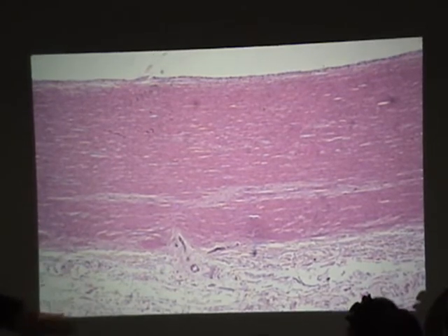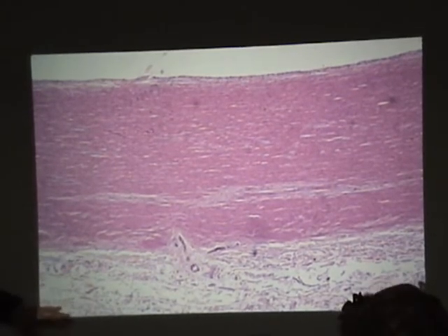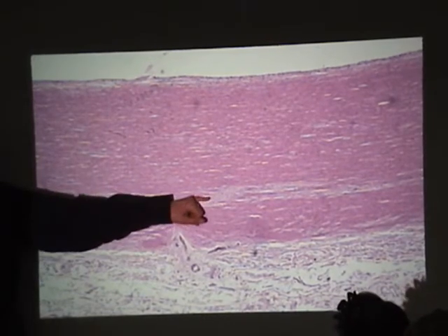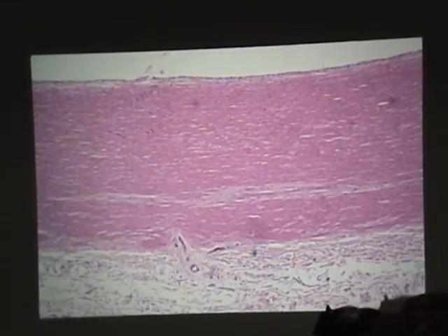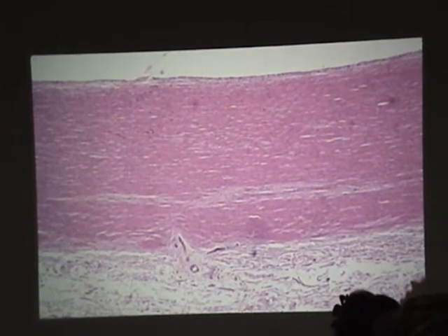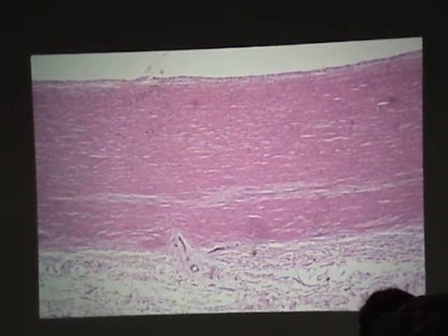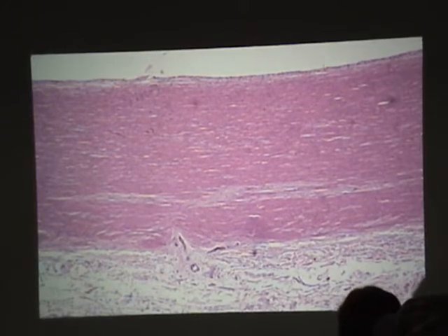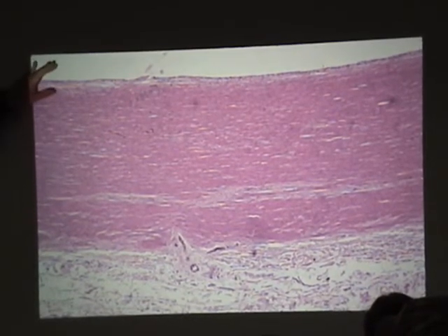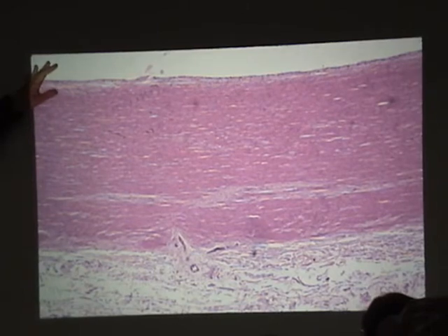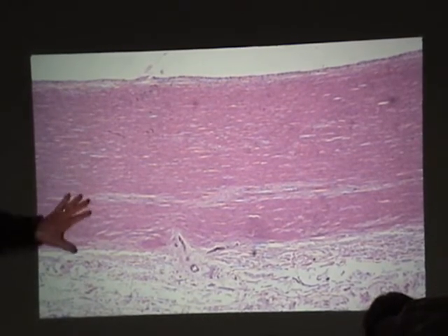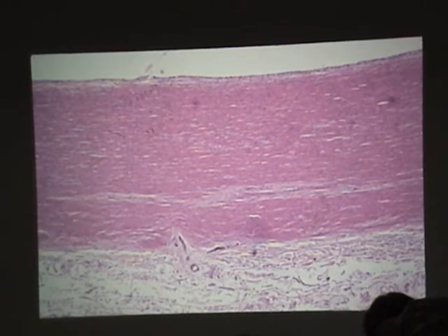Down here we have the adventitia. These structures here are connective tissue, but also the vasovasorum — blood vessels of blood vessels. On larger vessels, you can't use diffusion to get nutrients down here and waste products out, so you just have their own vascular tube.